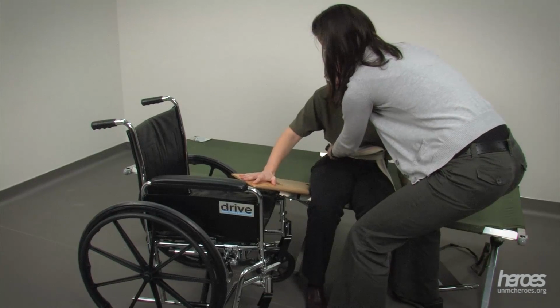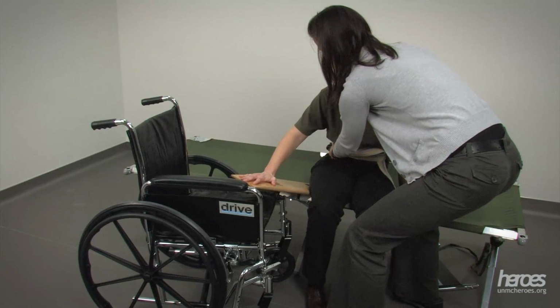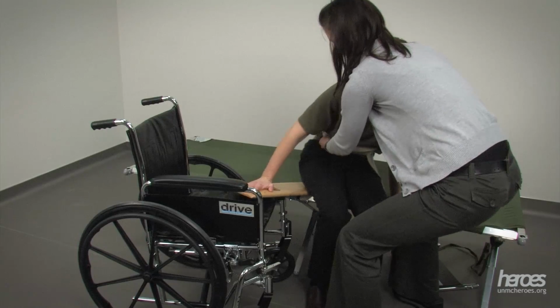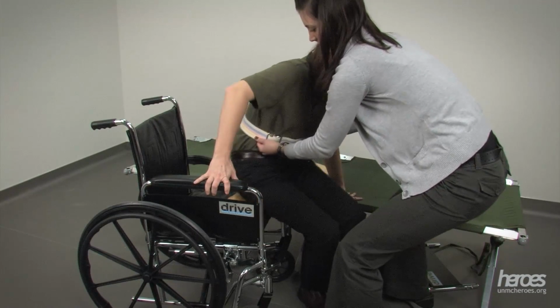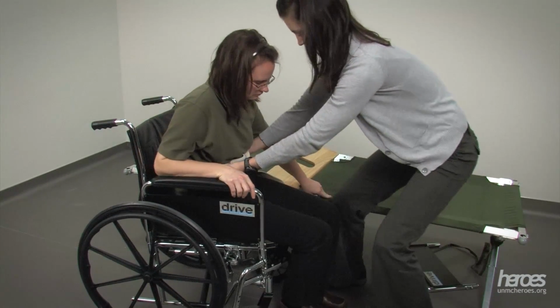If the individual is not able to do small push-ups, they can move their buttocks across the slide board by scooting sideways using a series of small movements. For either technique, help the individual by guiding their trunk with your hands on the gait belt. And if the individual is able, ask them to push through their feet as well to help move across the slide board.